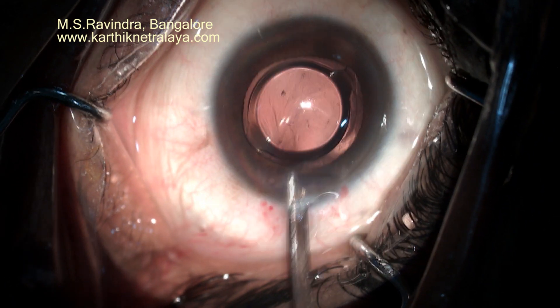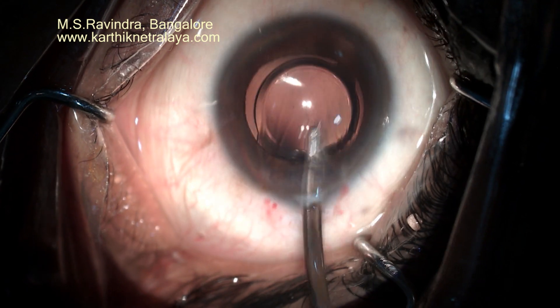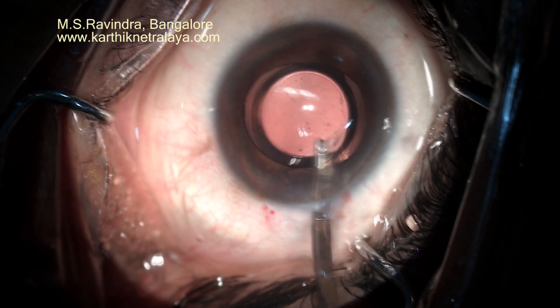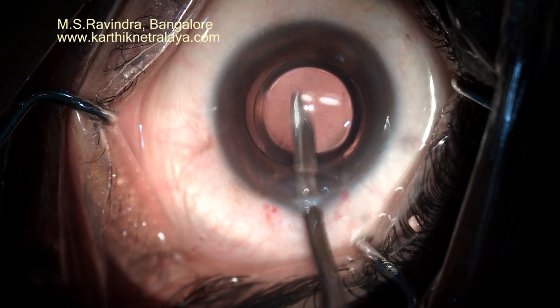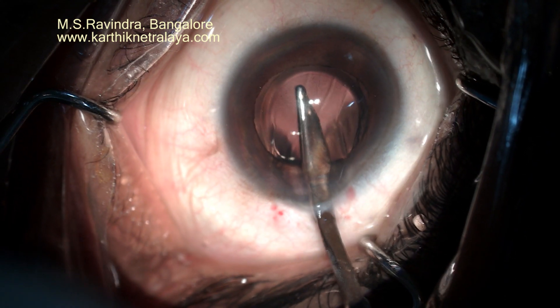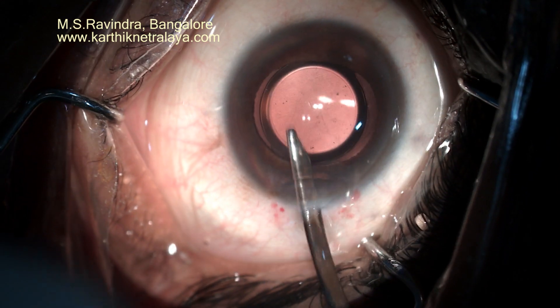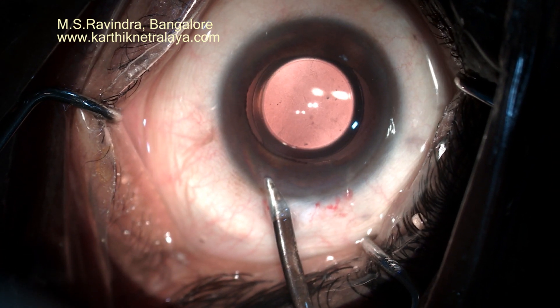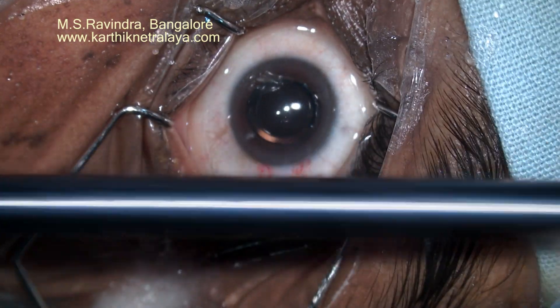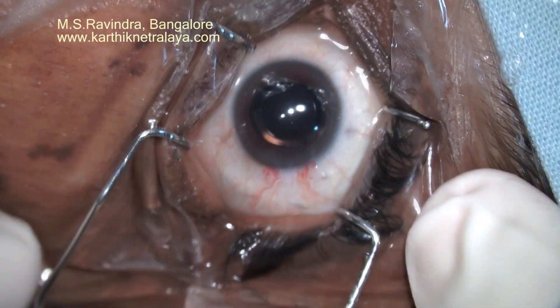There is no need to hydrate the tunnel as it is not stretched at any point of time. This tunnel gives an astigmatism of maximum half diopter postoperatively. SIA is less than half a diopter in most cases. The lens is pressed backwards so that it sticks to the capsule. That is the pusher which is used to insert the lens through the cartridge.